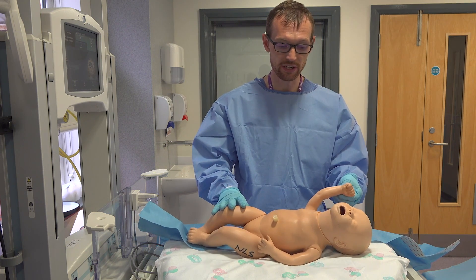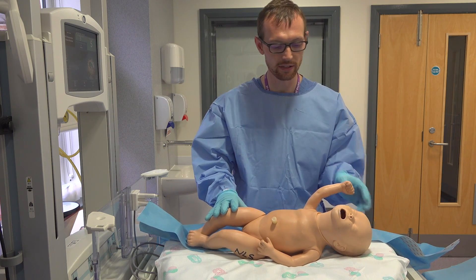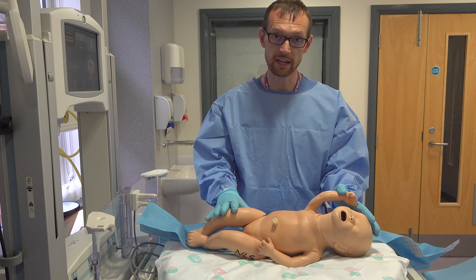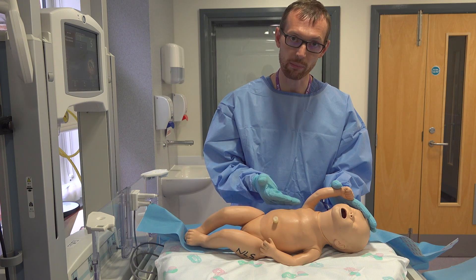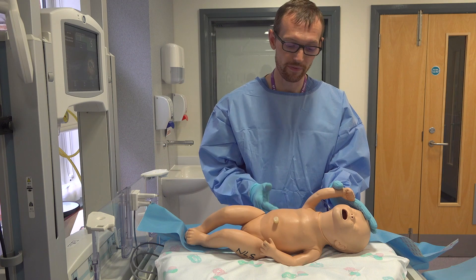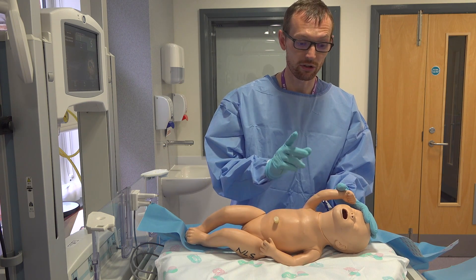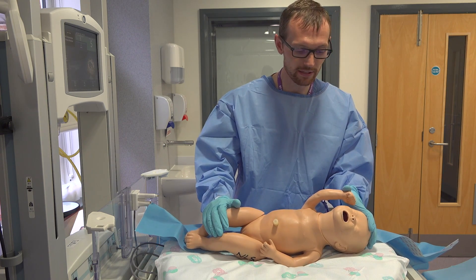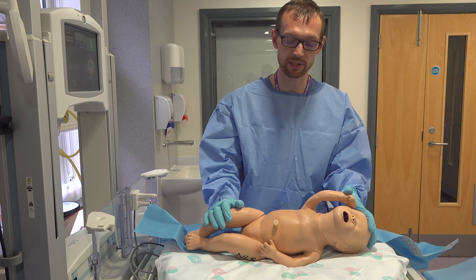Note the position I have the baby in. We have a right-sided pneumothorax. Baby's arm is lifted up and baby should be tilted so that the free air will come up and you'll be able to hit the air pocket easier. You will always have an assistant to stabilise the baby and hold the arm above the head. So that is our position.